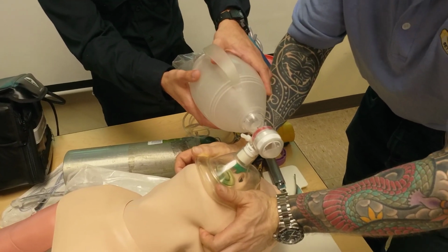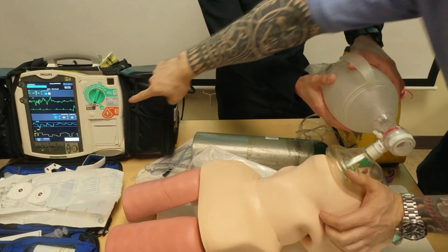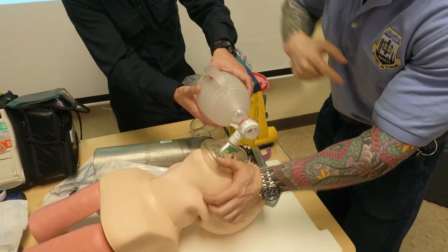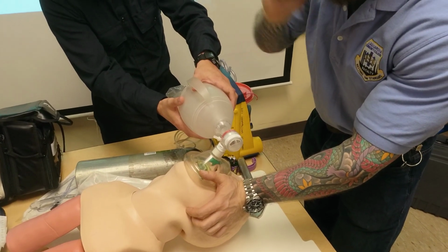So I'm going to do this for how long? 2 minutes. At the same time, I'm looking at the pulse ox and my end-tidal CO2. Every time he squeezes the bag, I expect that square box. So I'm looking and listening for 2 minutes. Pulse ox what? 100. Make sense? So this is what I'm doing.